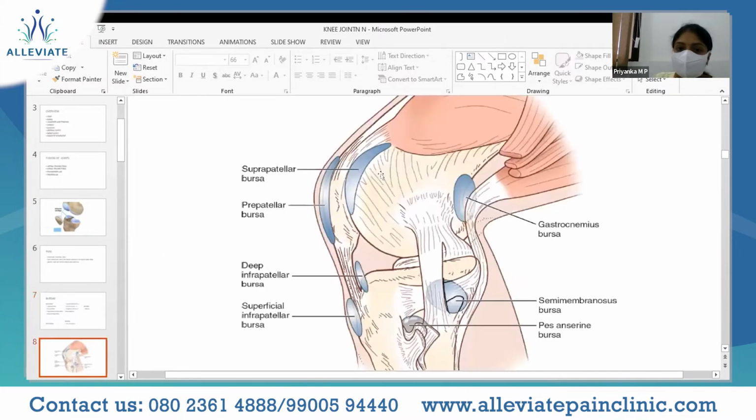So in this slide, we can see here it is a suprapatellar bursa. Over the patella is the prepatellar bursa, and patellar ligament, below the patellar ligament will be the deep infrapatellar bursa, and superficial to that is superficial infrapatellar bursa. And this is the gastrocnemius bursa. Below the semimembranosus attachment is the semimembranosus bursa, and below the pes anserinus attachment is the pes anserinus bursa.